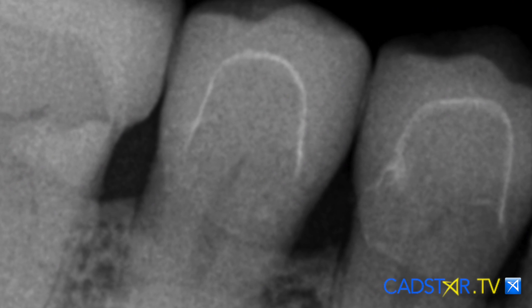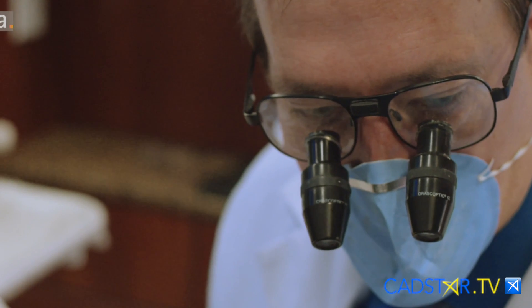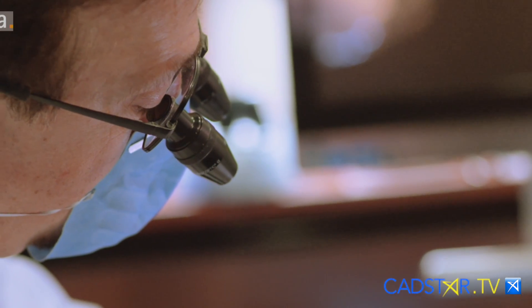Take a look at these margins and how precise they are. When I know I'm drawing my margin in the right location sub-gingivally, I have a lot more peace in my heart before I ever mill, because I know it's going to be right on. So try this tip — you may like it.